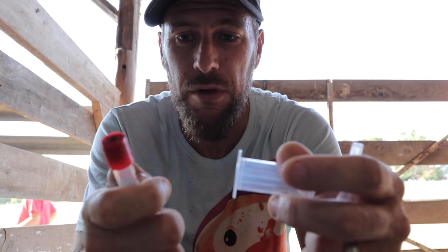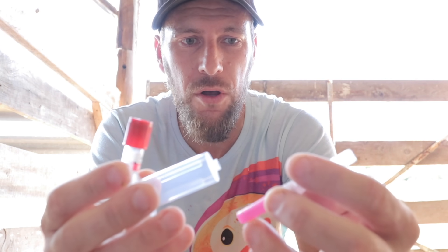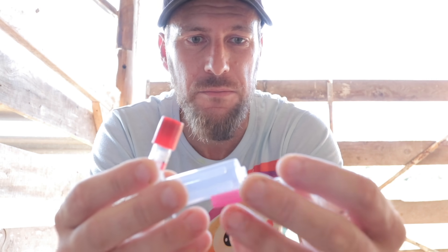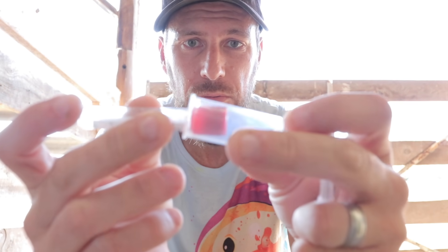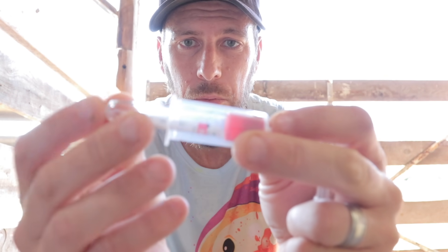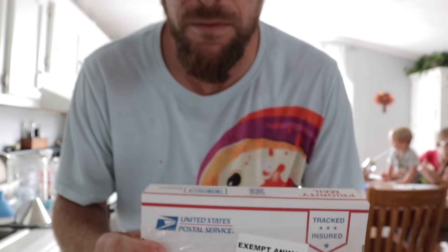We did that, and we're gonna check today to see if she is pregnant. So we got a blood test. There are three parts of this kit - we got this kit through Bioprin. They send us a 10 or 12 package kit to test a cow for pregnancy. There's a tube part and a needle part that screws in, with a stick that goes into the tube. Once we hit a vein, we create suction and put blood right in there. Then we send this blood off to get tested.